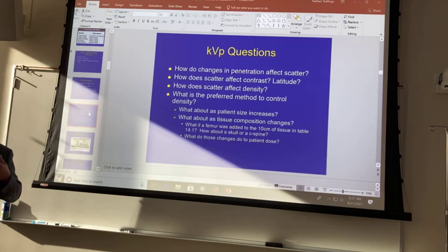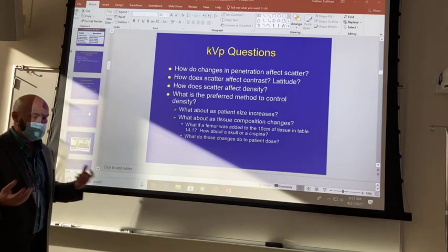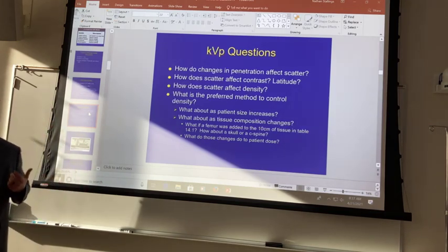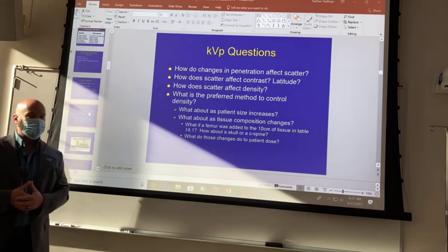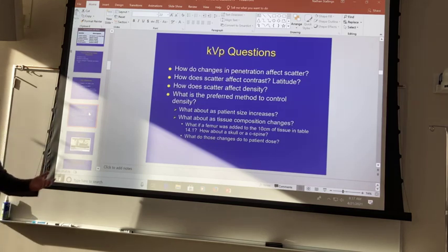We have different types of pathologies that actually increase bony tissue. Osteopetrosis, not to be confused with osteoporosis, which is loss of mineralization in the bones, right? You lose calcium, you lose the phosphorus, all the bony minerals, and the bone gets very radiolucent. Osteopetrosis is the exact opposite. We get much more dense bones. So in those cases, you might increase your kVp, right? But most of the time, it's going to be mAs.